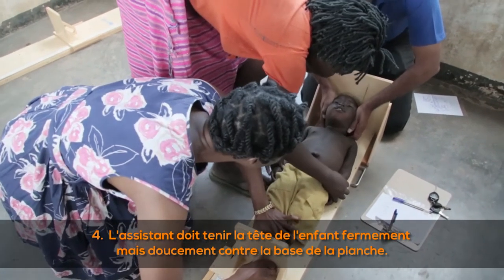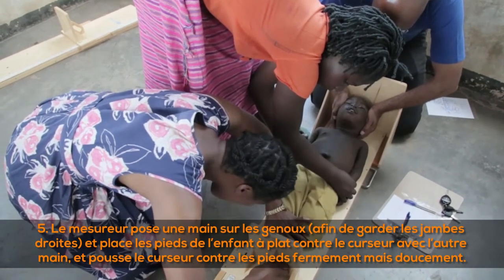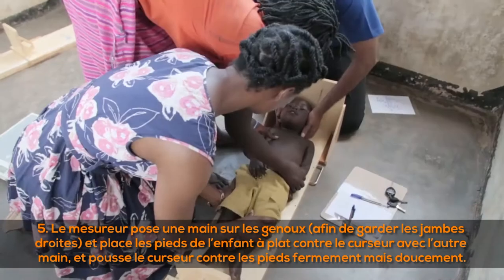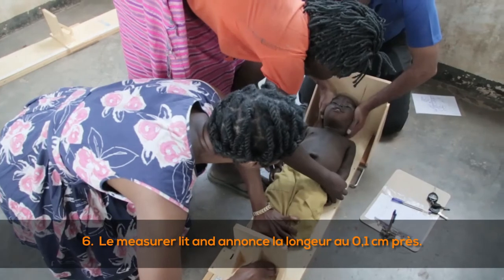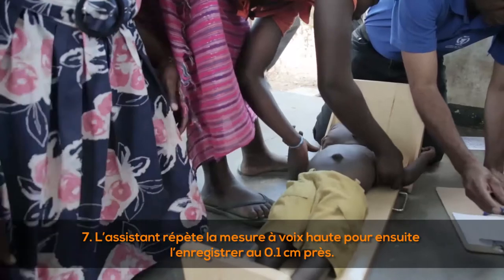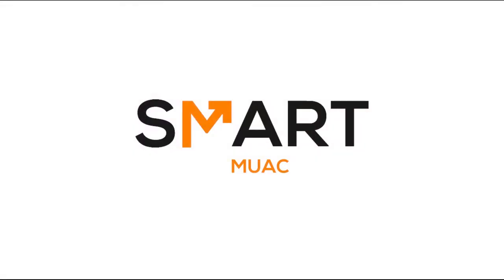The child should lie straight in the middle of the board, arms at their side, looking directly up. (4) The assistant holds the child's head firmly but gently against the base of the board. (5) The measurer places one hand on the knees to keep the legs straight, places the child's feet flat against the movable part with the other hand, and pushes it against the feet firmly but gently. (6) The measurer reads and announces the length to the nearest 0.1 centimeters. (7) The assistant repeats and records the length to the nearest 0.1 centimeters.